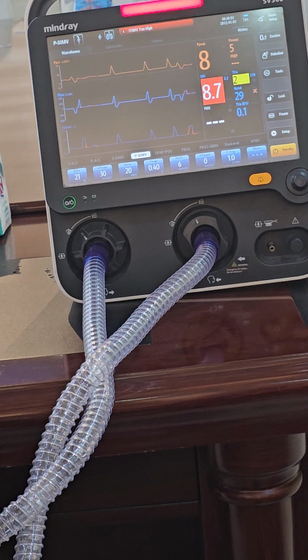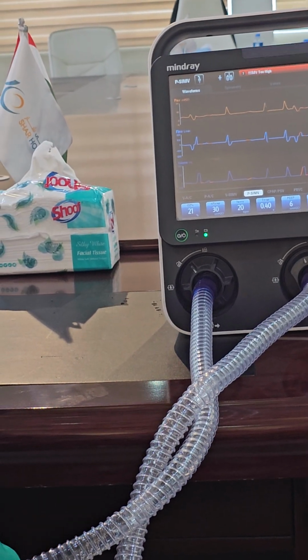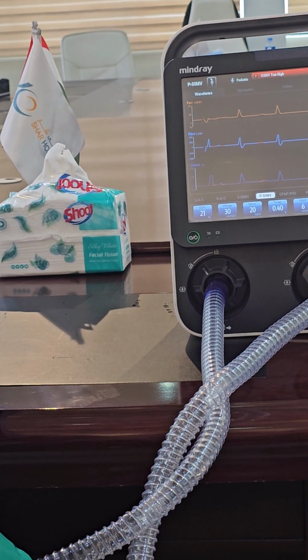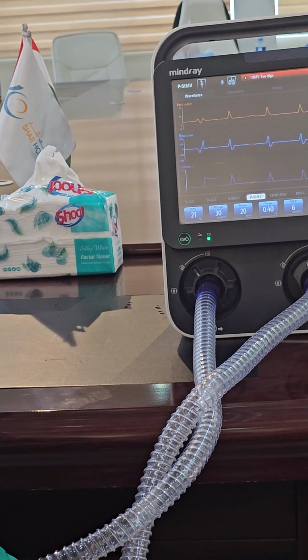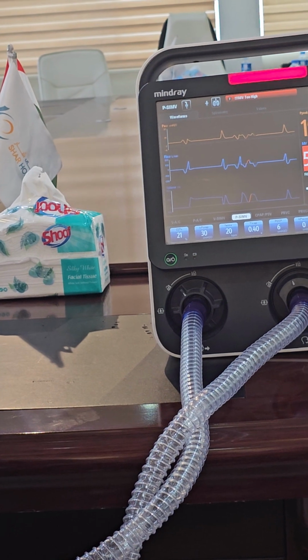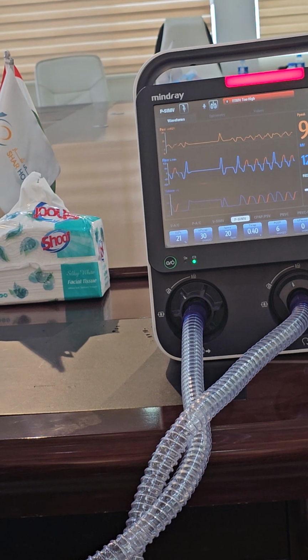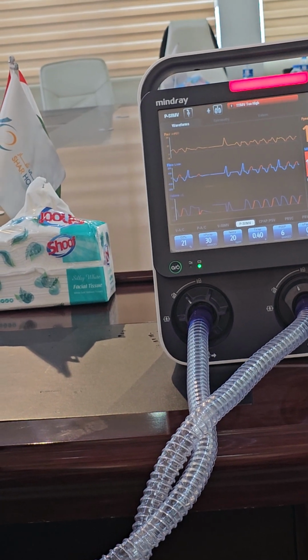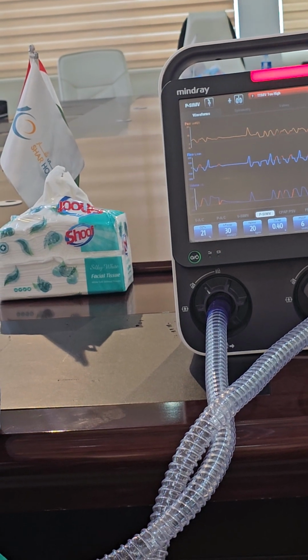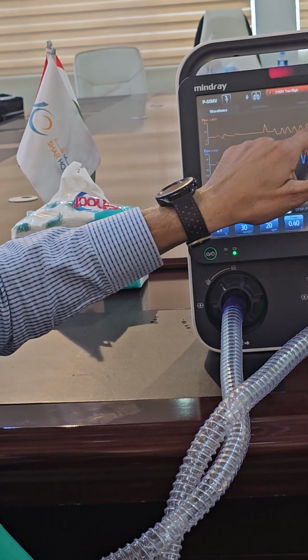Need less support. Synchronized intermittent mandatory ventilation. There is no assisted here, but they will never go against each other. You see? Not all breaths are assisted. Assisted only when the rate is coming. They don't fight together. You see?